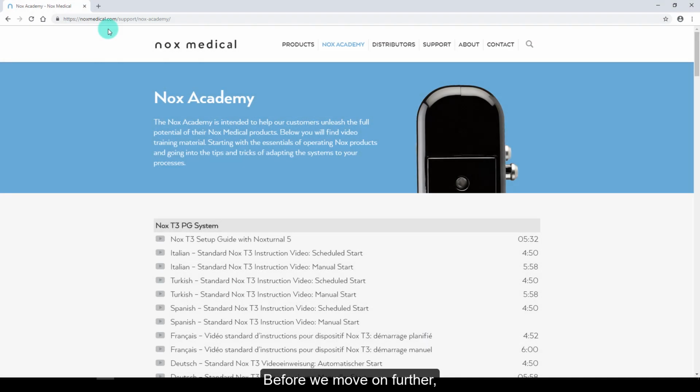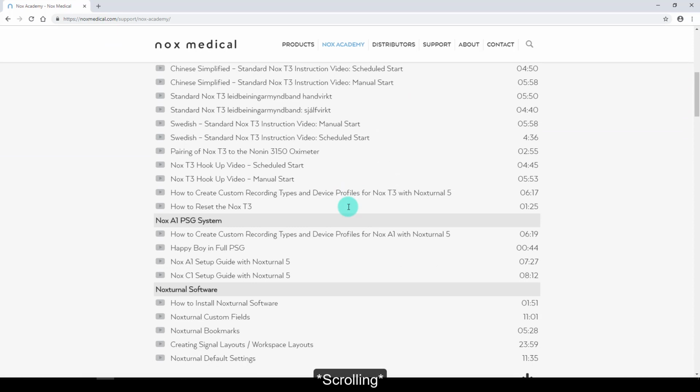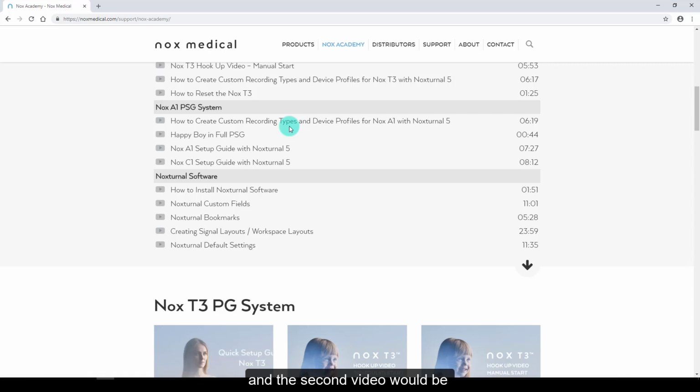Before we move on further, please make sure that you have watched the videos that are available on Nox Academy. We recommend that you watch 2 videos before proceeding with this video tutorial. The 2 videos are how to create custom recording types and device profiles for Nox A1 with Noxturnal 5. And the second video would be creating signal layouts or workspace layouts.